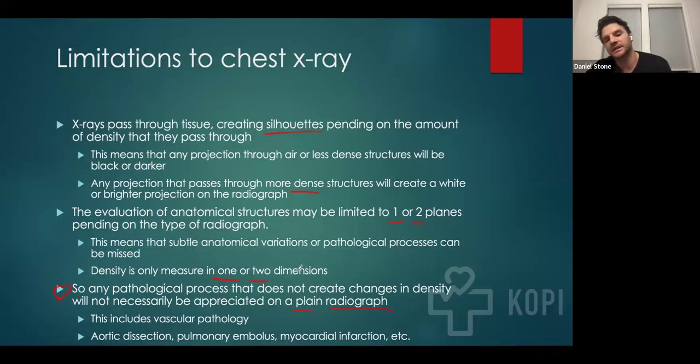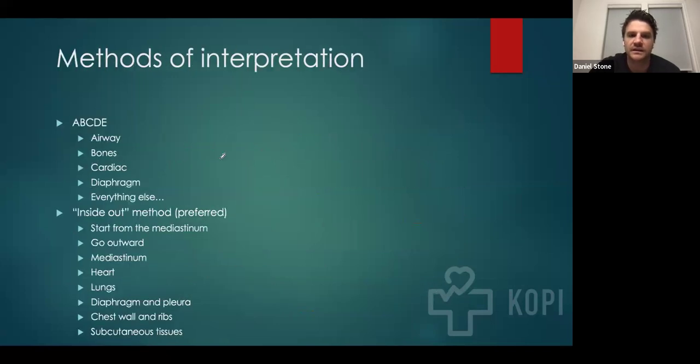When that happens, it certainly creates a situation where you can also talk about adding contrast or trying to enhance certain tissues. And if you can do that, then you can create a situation where pathology is more easily identified.